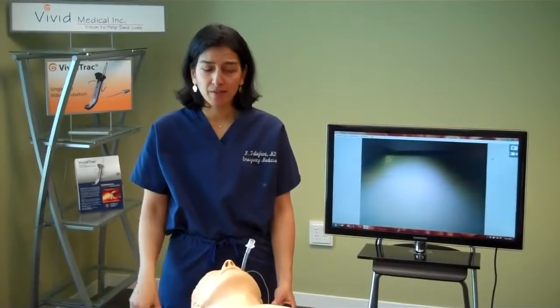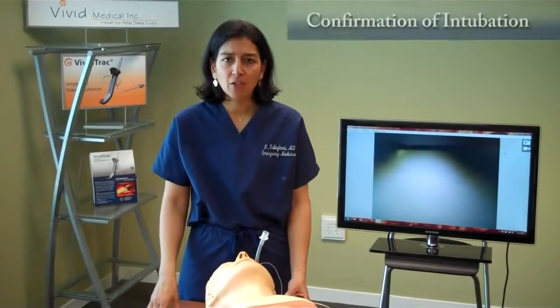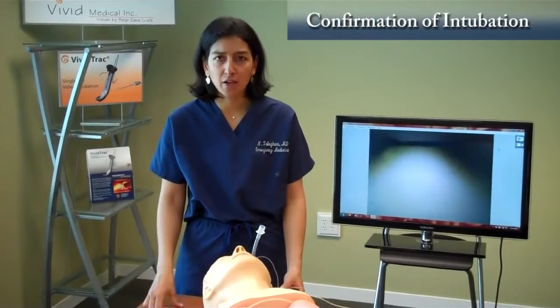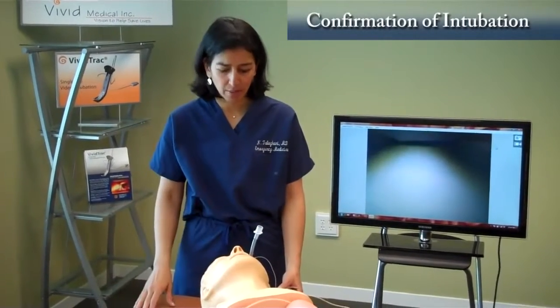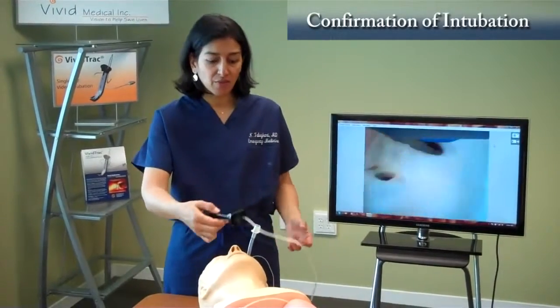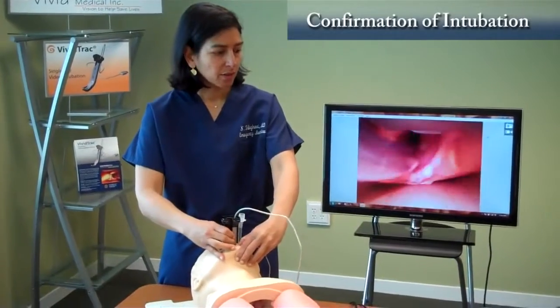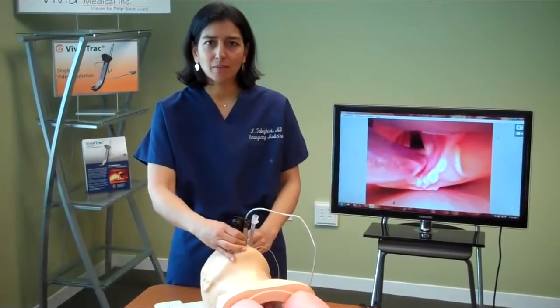So here's another pearl of this device. Let's say you want confirmation that the tube is still in place and it's in the trachea and you haven't accidentally dislodged the tube, whether in transport or by something else. One of the major advantages of this device is with the tube in place, you just reinsert it, and you're like, oh yes, the tube is in the right place.